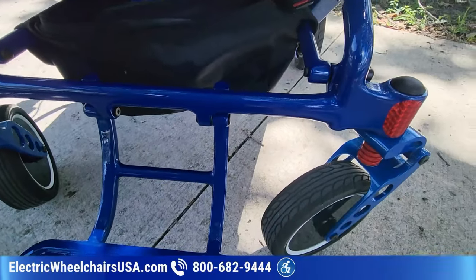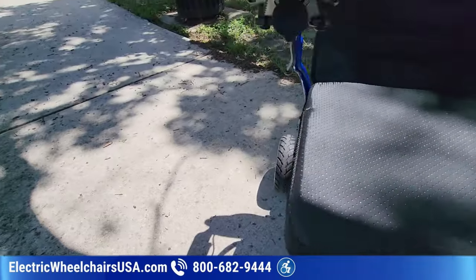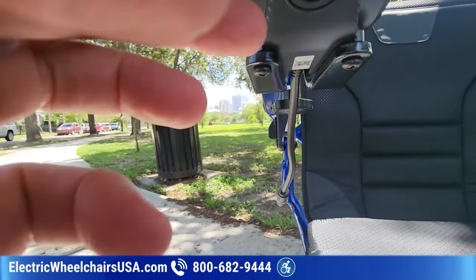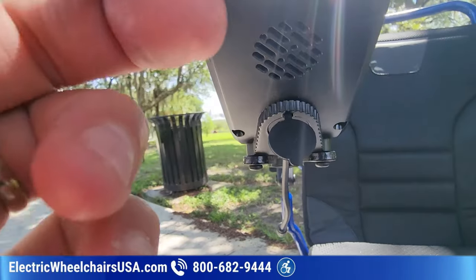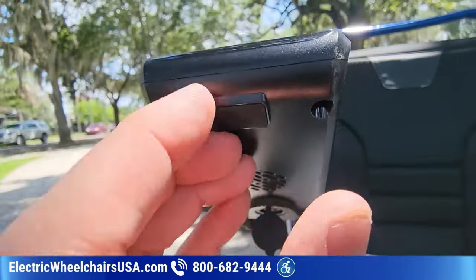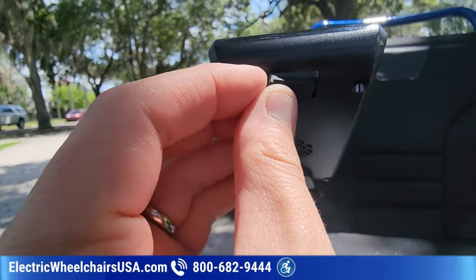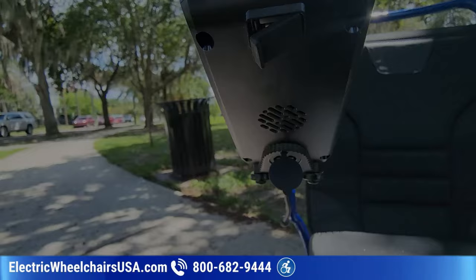Now, as far as charging the chair, as I said previously, you can charge it directly on the joystick right here. You also have a USB charging port right here, so you can charge your cell phone on this unit, which is nice.